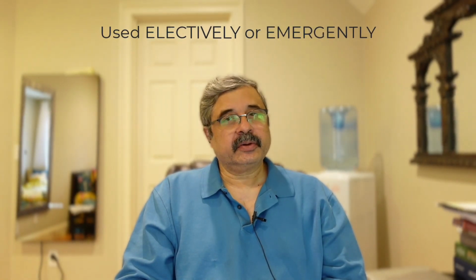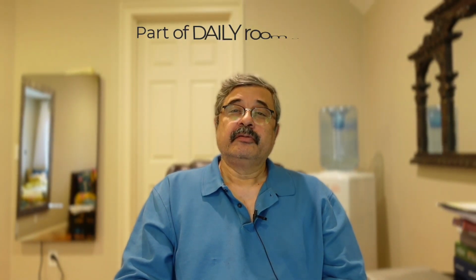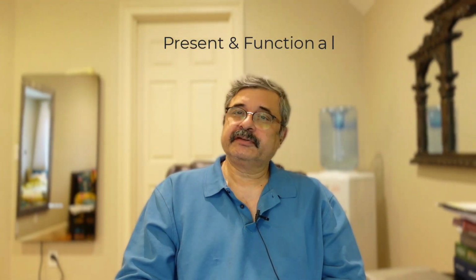So in conclusion, the LifePak is a critical piece of equipment in the heart rooms. It is used either electively or emergently to cardiovert or defibrillate patients. When working as a resident or a fellow in the heart rooms, it is part of your room setup and responsibility to ensure that this LifePak, number one, is present, and number two, is functional.